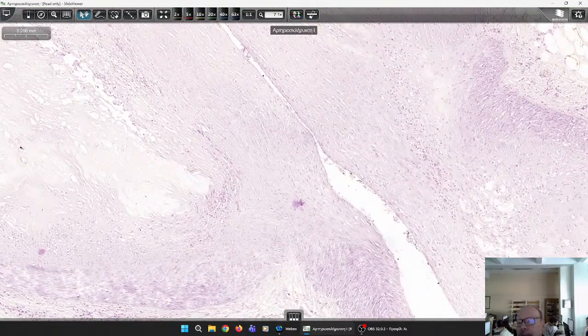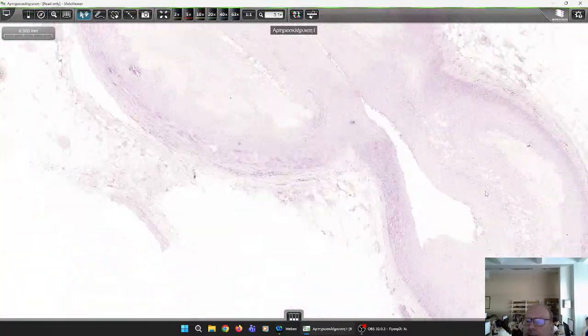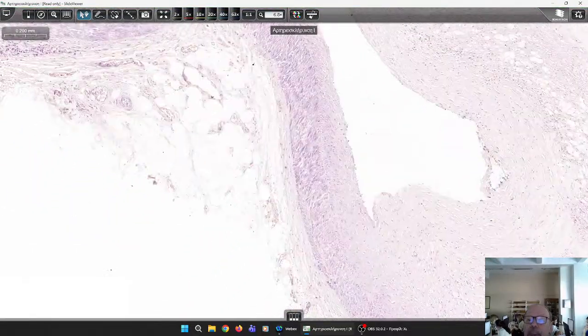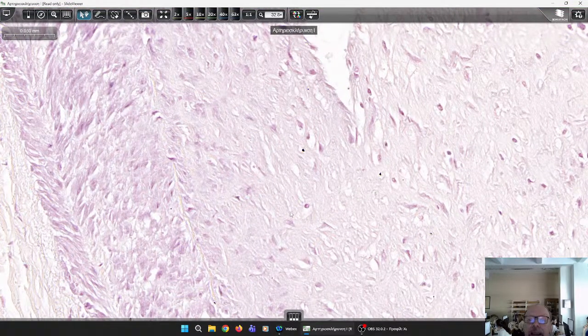So in this place, if we have erosion, there might be hemorrhage from the ruptured capillaries, and when this happens, what will be formed there?